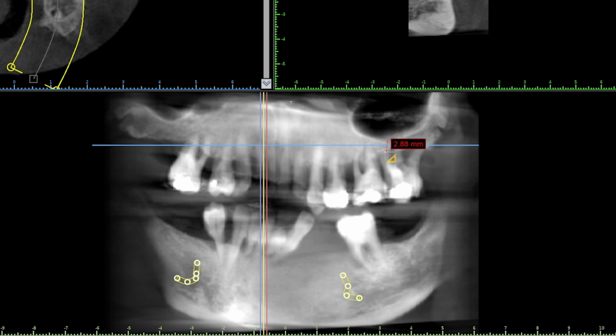The important figure is to take it off at the front, see how many teeth we need to take that off, and then we blend it into the bone level at the back. Okay, so all those people who've been told you can't have implants because you've not got enough bone, when we're doing a full set, it's pretty weird to see that we actually take away more bone. Now, the reason for this is if you're replacing 1 or 2 teeth, the position you put your implant in is completely different to if you're replacing a full set of teeth. I have touched on this subject before. It's a little bit complicated. I might make another video about it in the future.